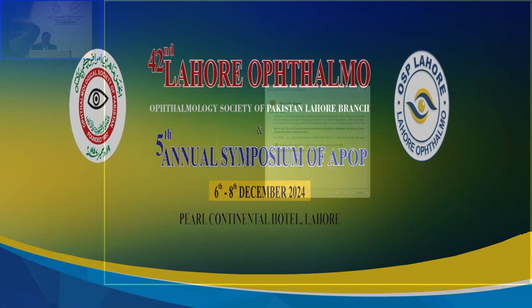Good evening, ladies and gentlemen. Today we are going to discuss automated IA, as I've seen some senior professors and most of the juniors doing manual IA, irrigation aspiration with the Simcoe cannula. But nowadays we can shift to the automated IA, and that's actually a very easy and safe technique.